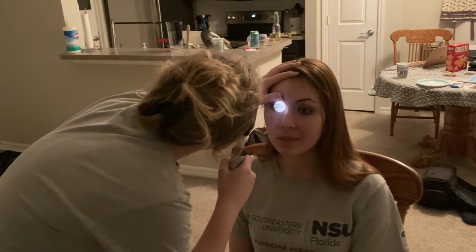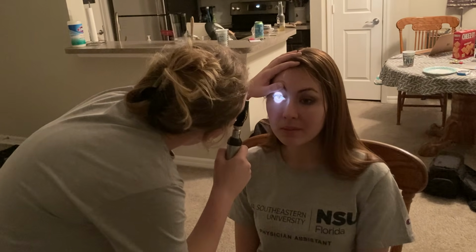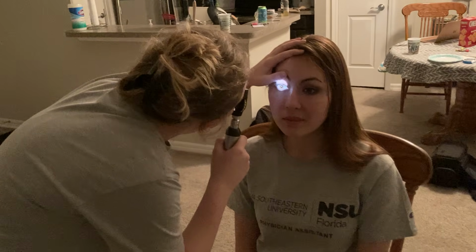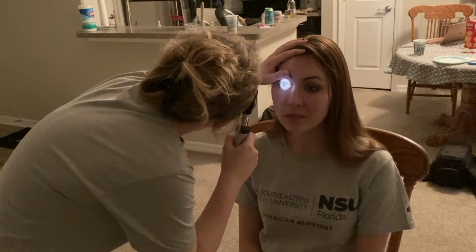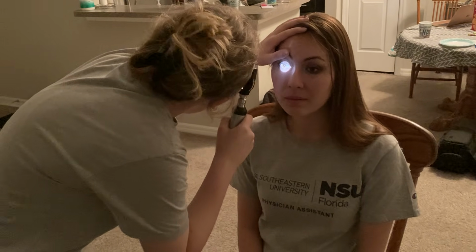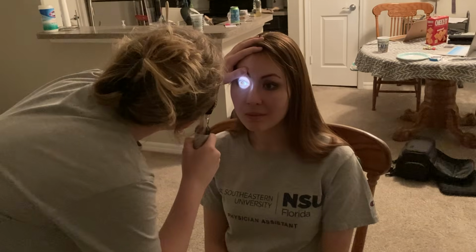Then I'm going over my 4 quadrants, and I see my AV ratio is 2 to 3, and I see no nicking, and I see no spasms, and I also don't see any hemorrhage or any exudates. So I'm going to have you look right at my light. Perfect, and I see no lesions in the macula.